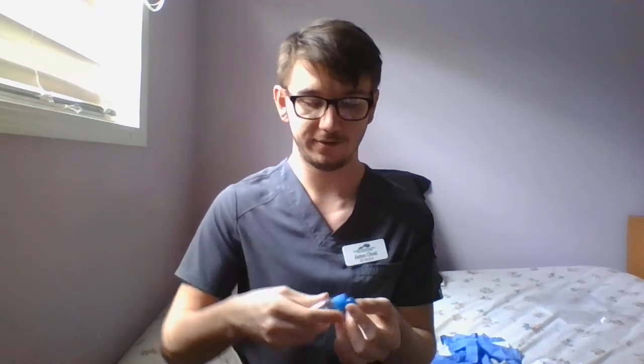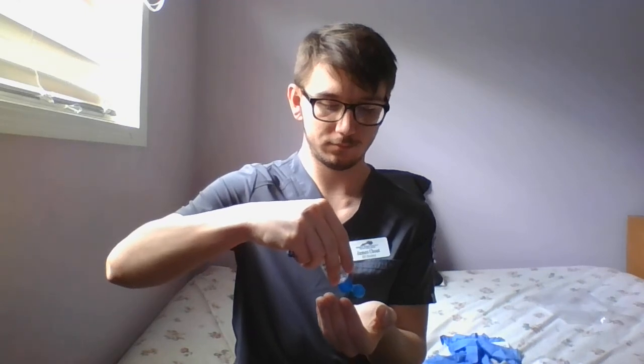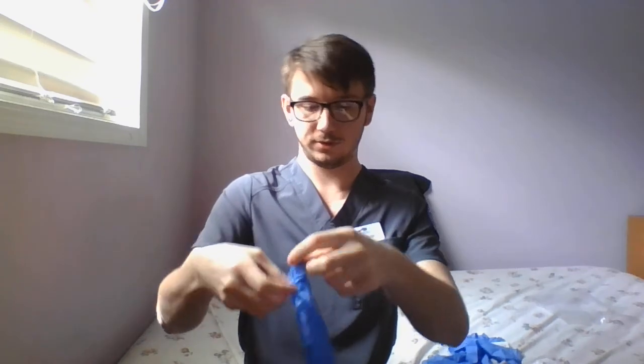In case it is necessary, I will repeat the 6 rights of medication again. You need to have the right dose, right medication, right documentation, right patient, right route, and right time. Alright, I'm going to perform hand hygiene. Gloves on.